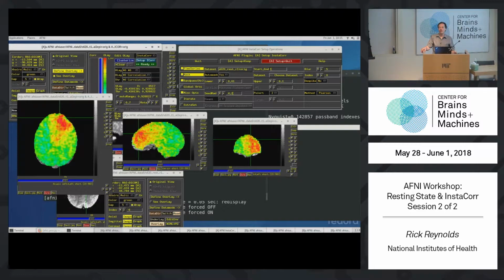This is one of the coils going bad a little bit, and if the signal drops down by a few percent for a few TRs, or maybe for a lot of time and goes up and down, who knows? When the scanner coils start going bad, at first it will change a little bit, and then as they get worse and worse and worse, you get more and more problems over time.